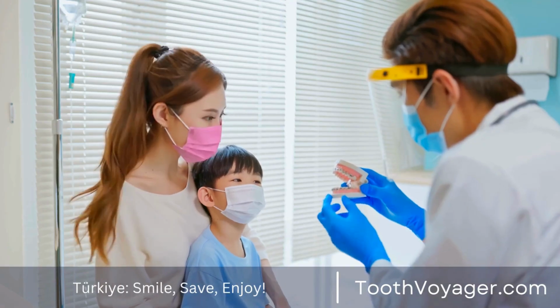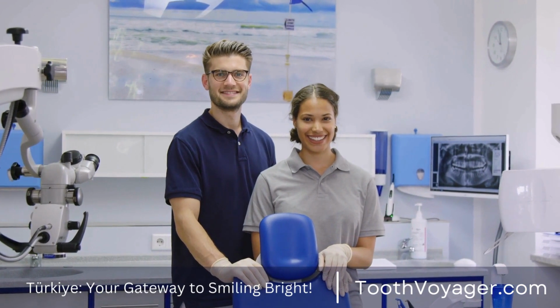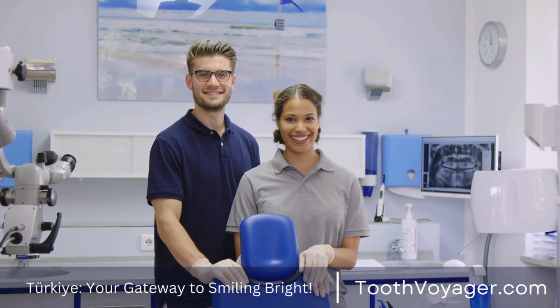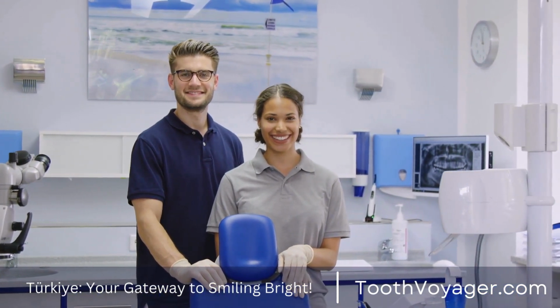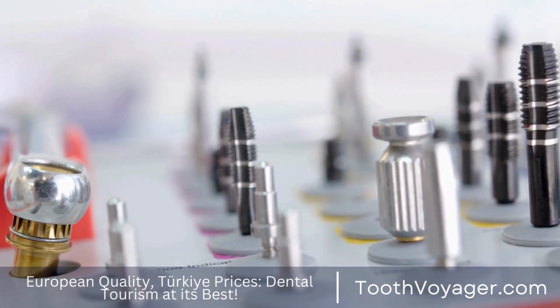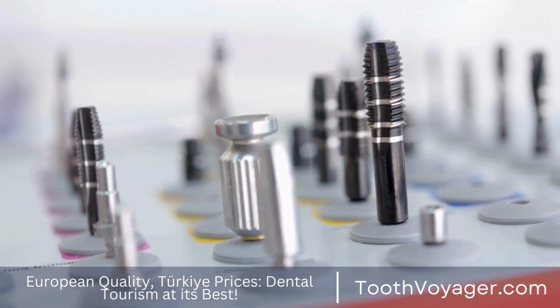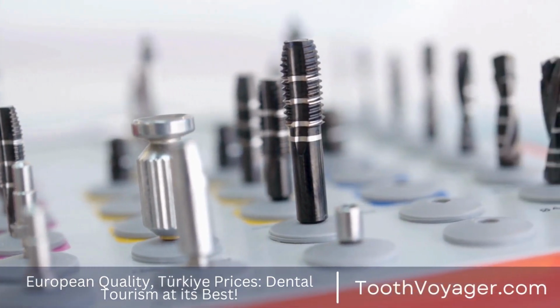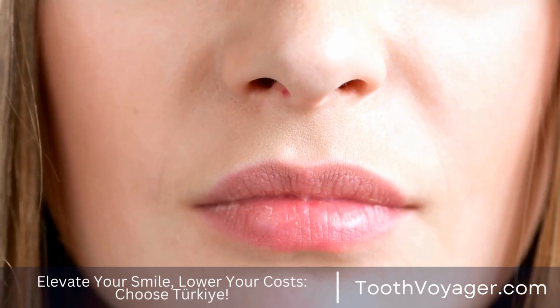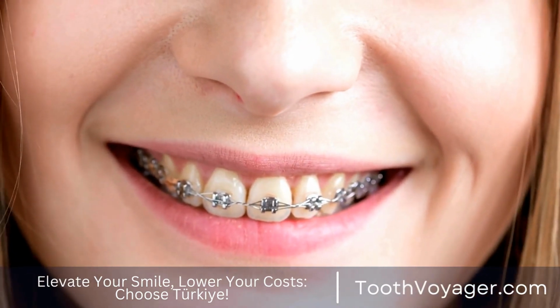3. Covering a discolored or misshaped tooth with a dental crown. Crowns made of porcelain can also be used to mask a discolored or damaged tooth. If a tooth has been severely stained or discolored, it is possible for a crown of dental material to be put on top of the tooth to boost its appearance. Dental crowns are also employed to conceal unbalanced or disfigured teeth to make a more even smile.